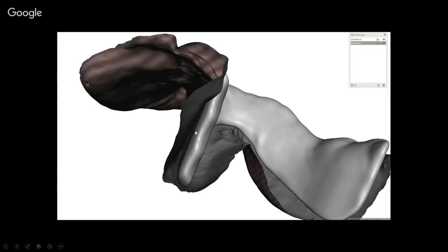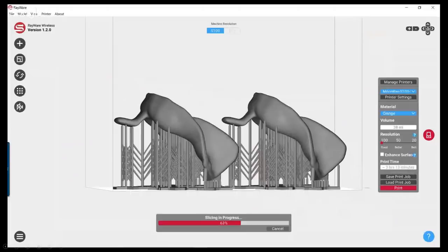If I was doing this on a physical model, I would just have to throw a bunch of wax down in there, and I would probably end up blocking it out excessively or not blocking out enough and have this thing get stuck on the model if I light cured it or auto cured it. So I did go into Mesh Mixer and just use the inflate tool to pull off a handle. You could just as easily use some triad gel or whatever and do that physically. Because again, this is a bit of a hack of the software. And so what I'm going to do is just 3D print this out now.